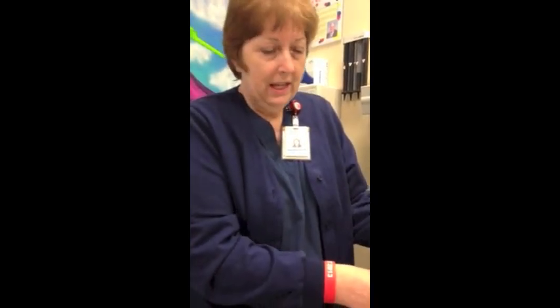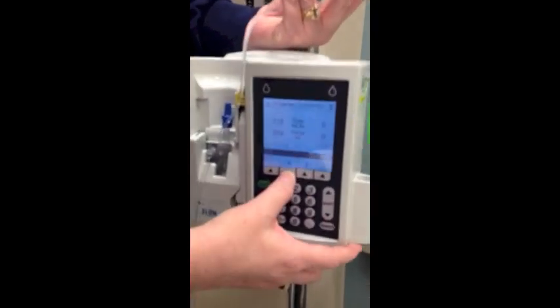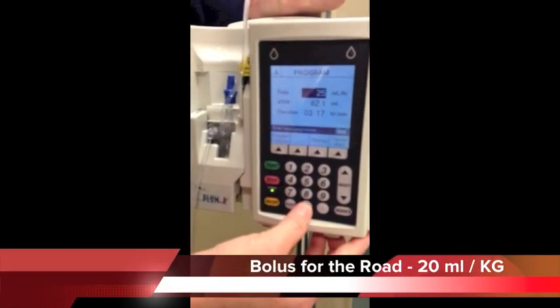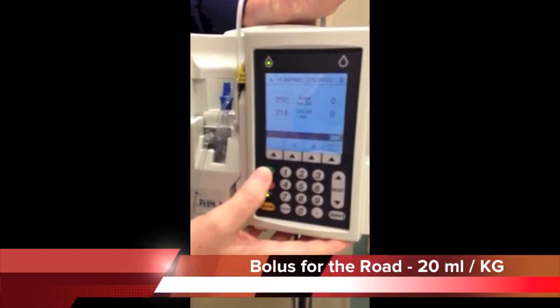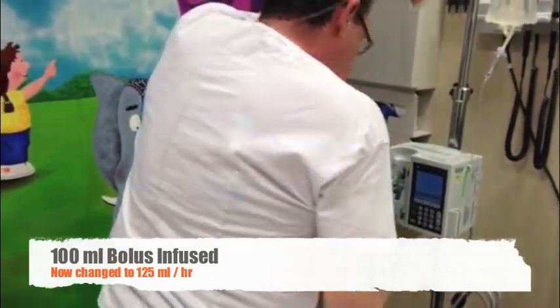I've heard that you can give them a bolus and then allow the patient to go home, and that will keep them hydrated such that they should do alright. Well, let's try that — I think that's worth a try. I understand the patient can even lie on it.